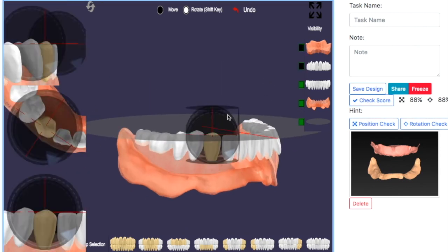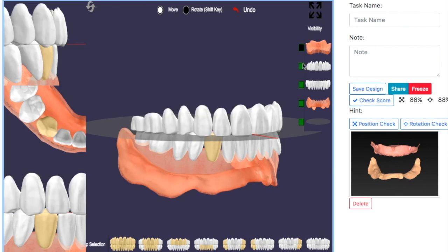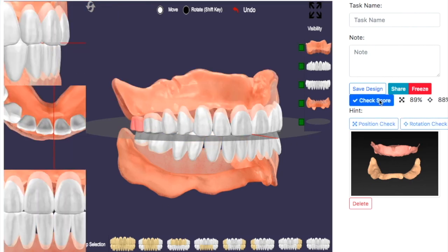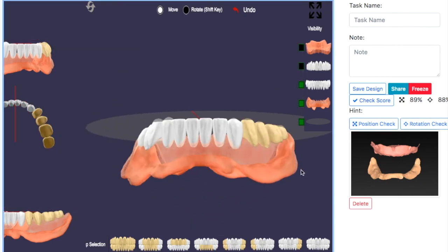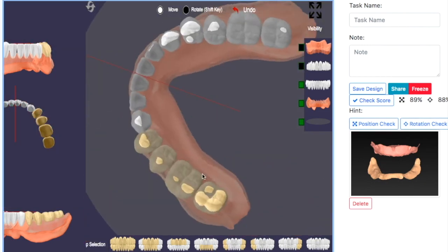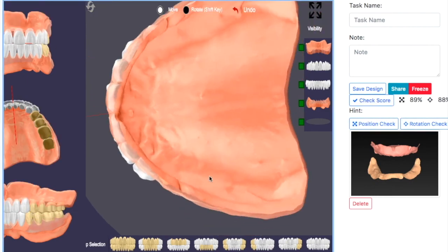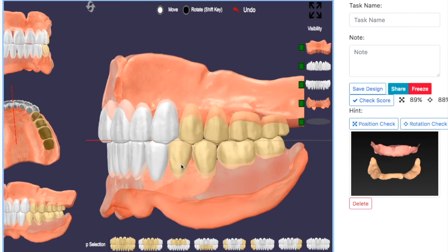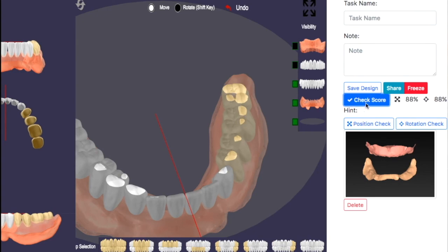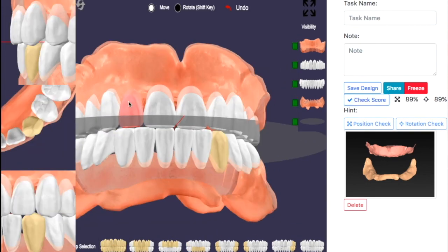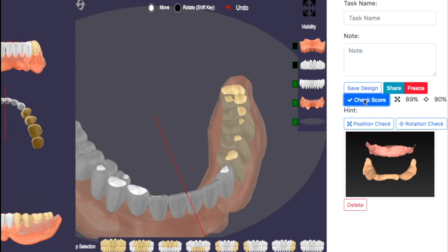Once you complete the setup of the posterior teeth, check the detail by checking the score. It will show which teeth are far off from the ideal position in red. Make minor adjustments to achieve a better score. The goal is that movement and rotation should be above 90%.